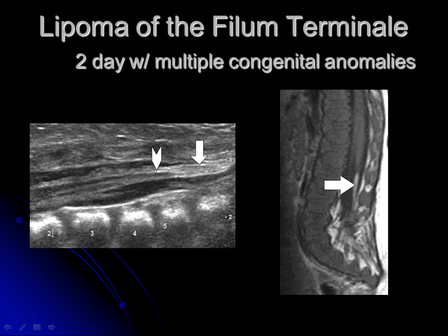Let's look at some abnormal cases. This is a two-day-old with multiple congenital anomalies referred for spine ultrasound. All these cases involve young infants where we didn't wait until two weeks because they had high pretest probability of being abnormal. On the ultrasound looking from L2 to L5, the spinal cord is abnormally elongated and all low in position — it's hard to tell where the cord ends and the conus begins. It's also hard to tell where the conus ends and the filum begins because it's all thickened with echogenic material. Fat is echogenic on ultrasound, so this is suggestive of a lipoma, which was confirmed on MRI.